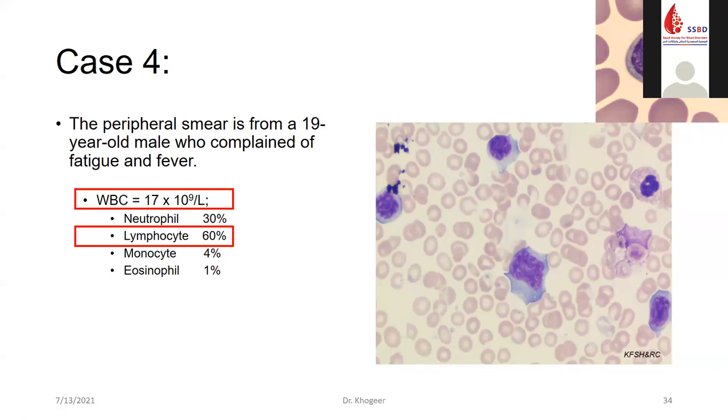Lymphocytosis in general can be divided into those with reactive morphology and those without reactive alteration. Causes of reactive morphology are usually viral infections like CMV, HIV, and herpes, although other bacterial infections may also cause increased lymphocytes, like syphilis. An example of non-reactive morphology would be whooping cough, caused by Bordetella pertussis.